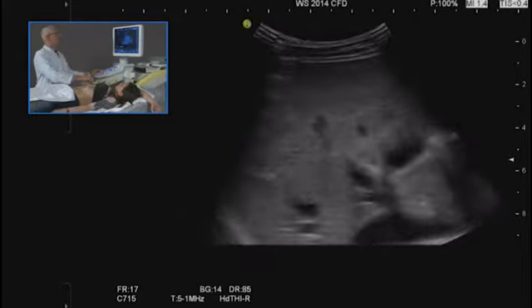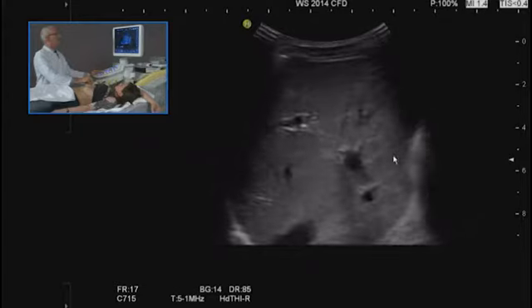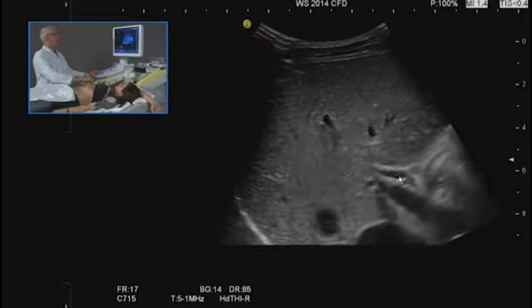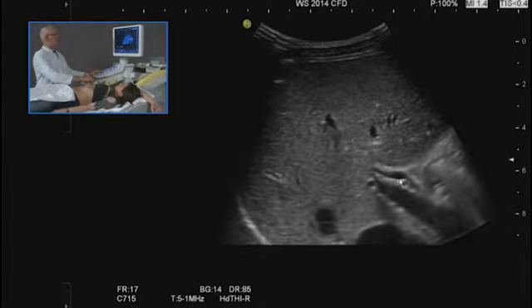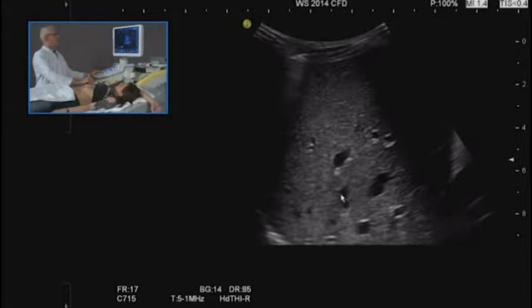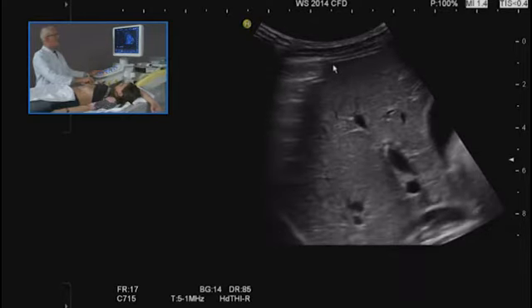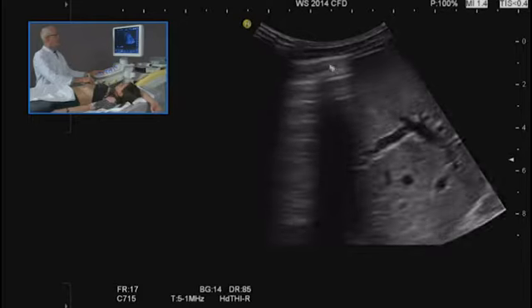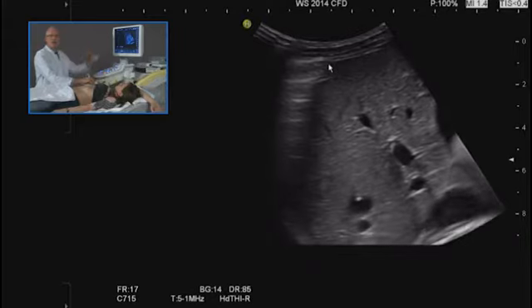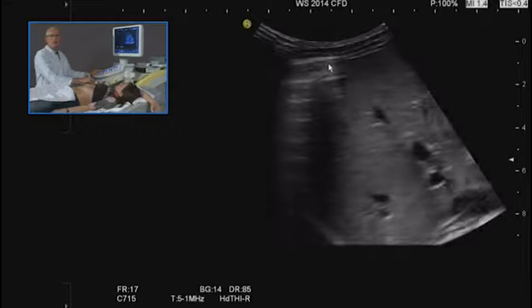The intercostal approach allows to analyze the gallbladder nicely, the bile ducts as seen with the marker, the portal vein, the right liver vein, and next to the transducer, take a little breath, stop, the costodiaphragmatic lateral part of the pleura for exclusion of pleural effusion.